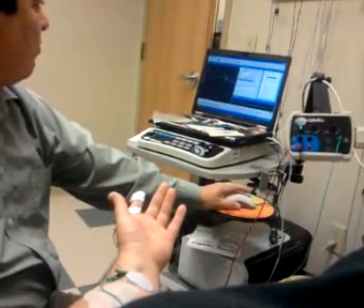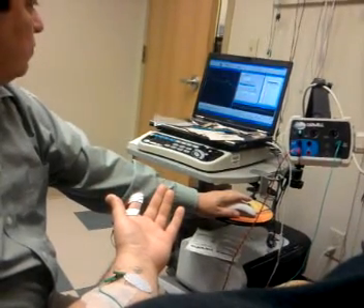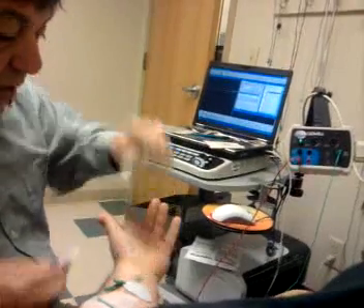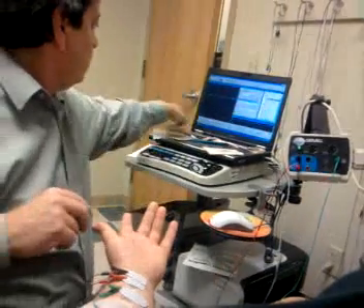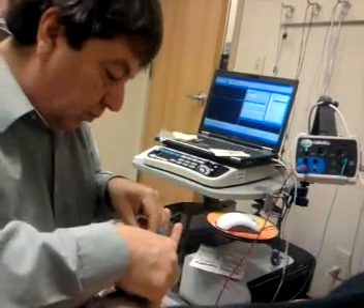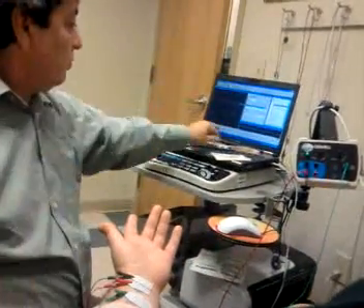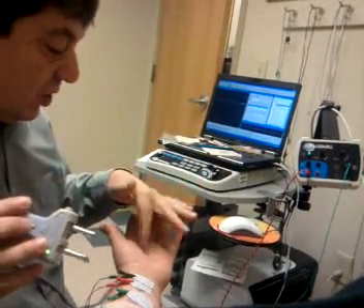So we just averaged the signal to find the best wave for the patient. That's the one that actually goes through the carpal tunnel, and that's why it makes you feel that sensation. Also why the pinky typically doesn't go numb — because most of the time on most humans, it doesn't reach over that part, although we have lots of variations.